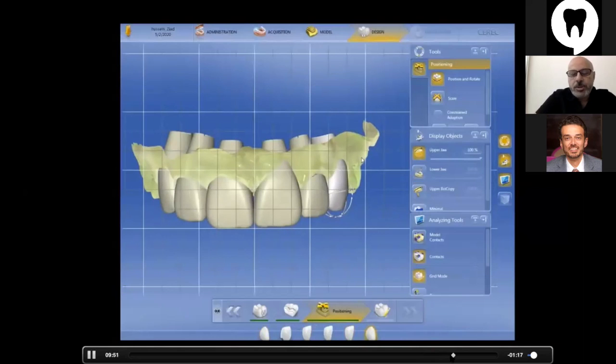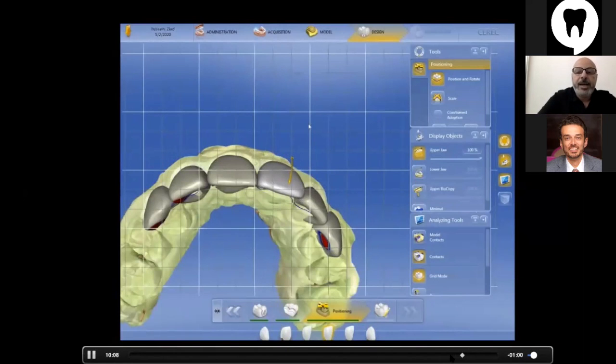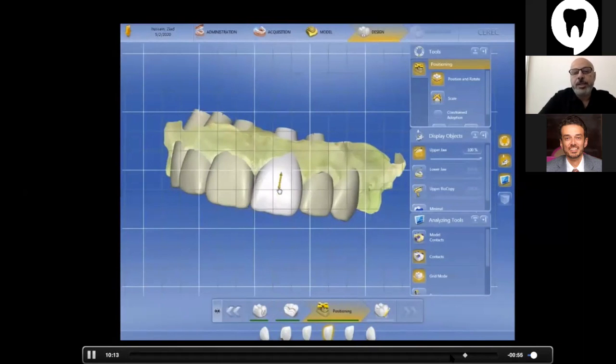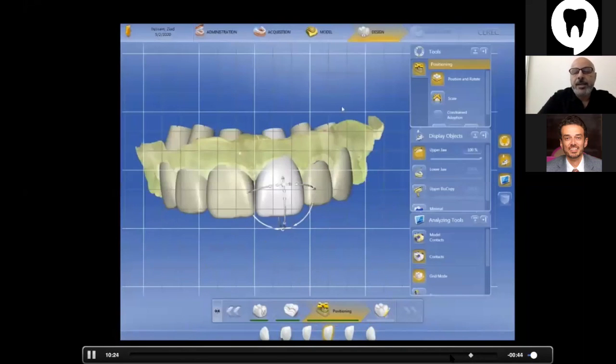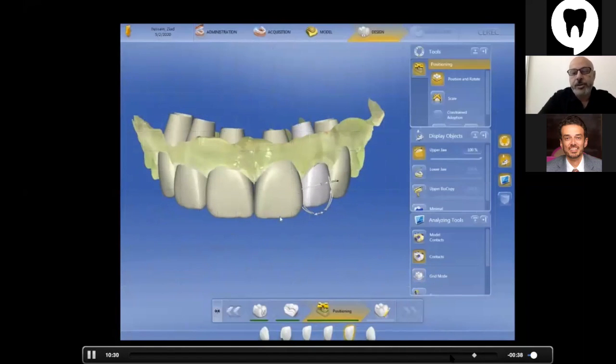Before going to the proposal, of course, we just make sure that your positioning was correct according to the grid lines, according to the alignment. And so in this way, we use the grid mode, the grid tool actually, to make sure that the length of the teeth and the alignment are correct, to make sure the differences of the laterals from the centers are the same in both directions and both sides. Also, the canines are correctly located and aligned, ensuring that their tip is on the smile arc you desire later on.